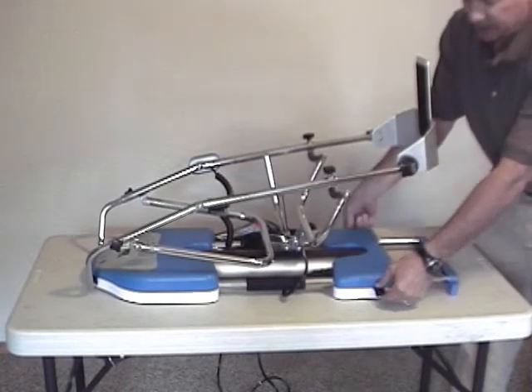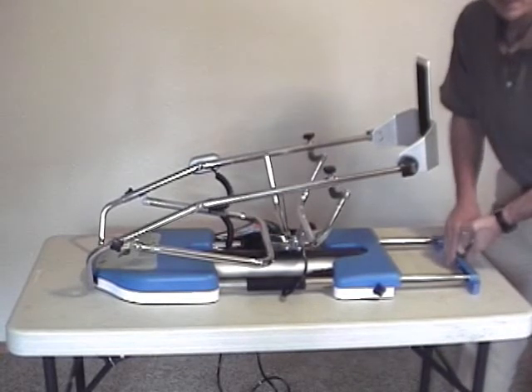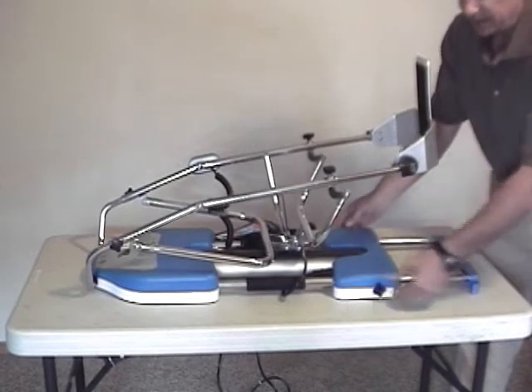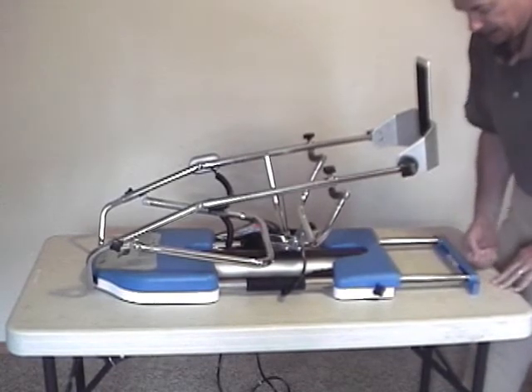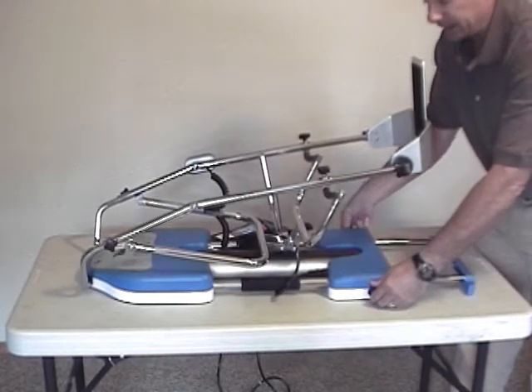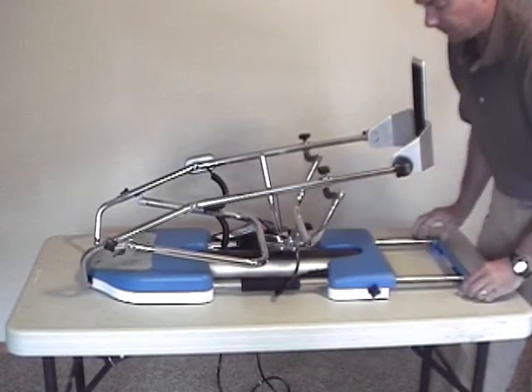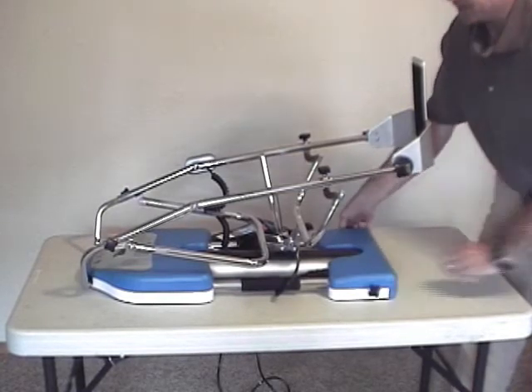You've got a knob on either side to loosen. Slide this out to the position where it's butted up against the foot board of the bed, then tighten these knobs back in place. This will help keep the machine from sliding away from the client. For storage or transport, slide that back in.